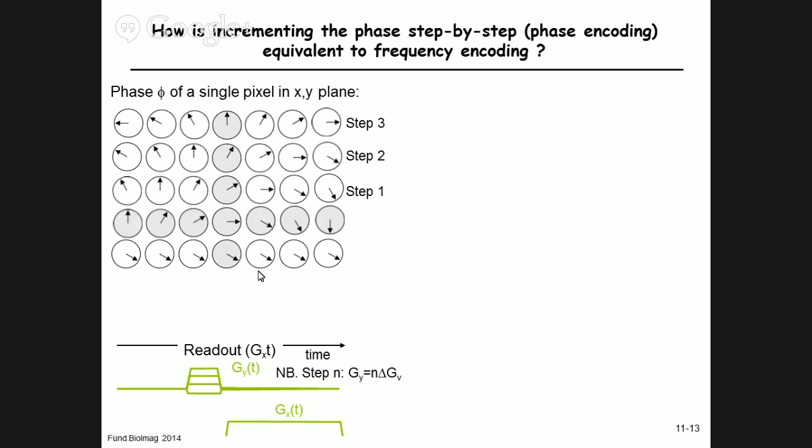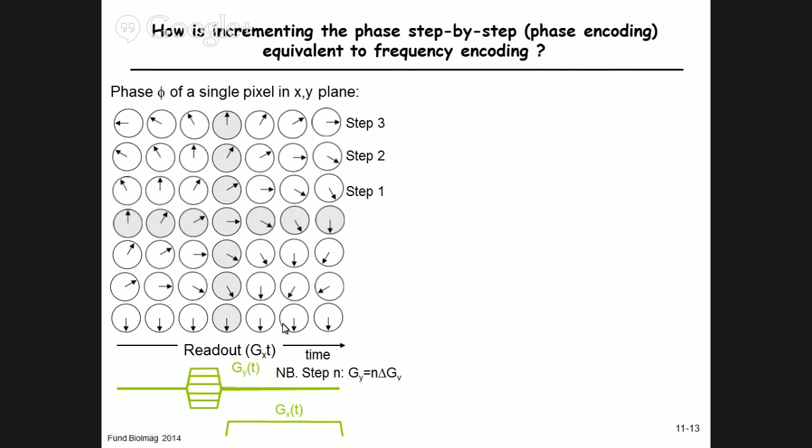And we'll do the opposite now with a negative gradient. So we'll start out after gy, the phase is twisted in the opposite direction. Here was twisted upwards, here's twisted down or rotated. This is the application of the x gradient, etc. and so on. We have one more here, we'll do that again.